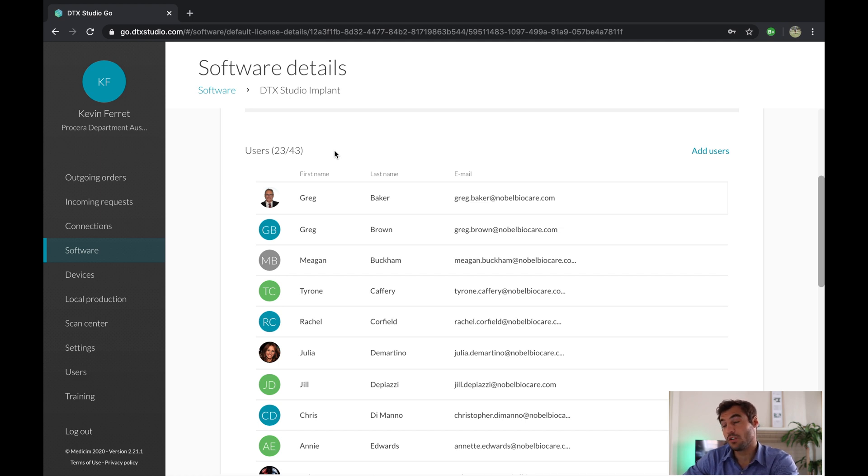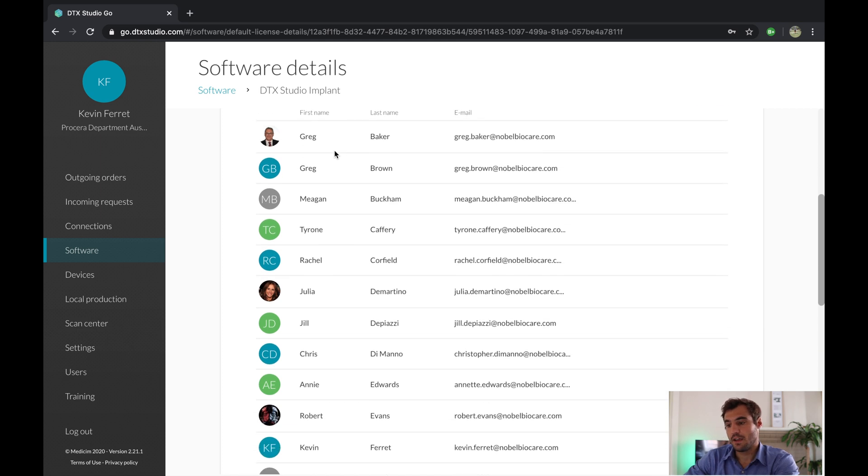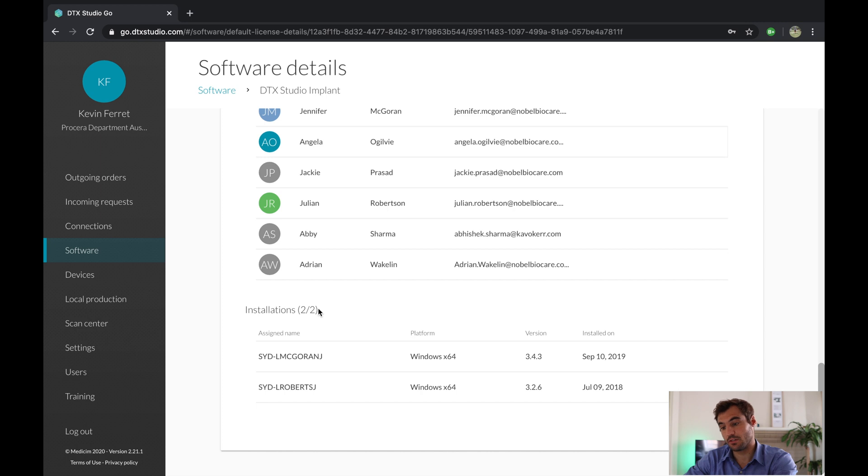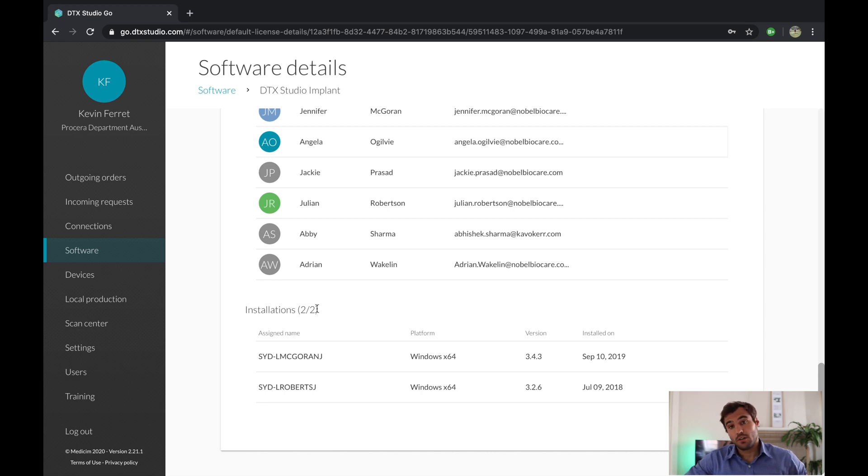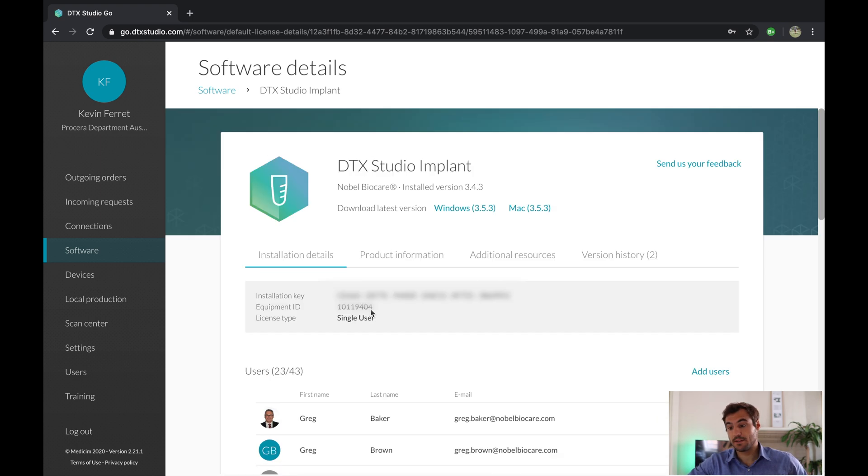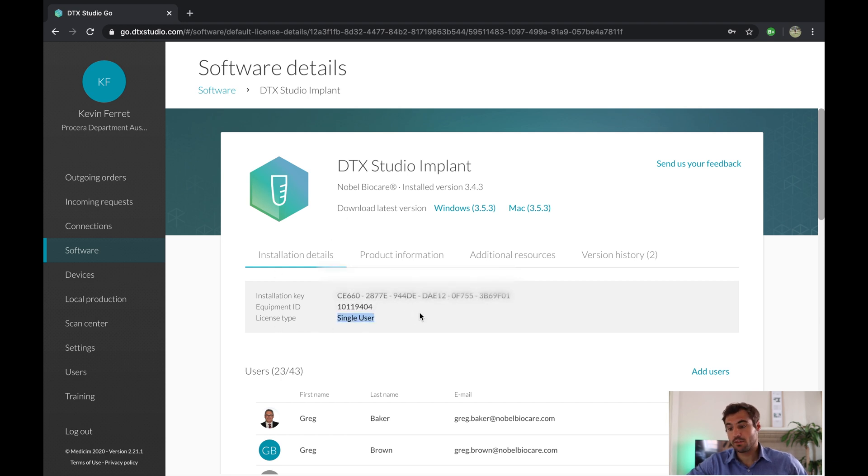And all the way down to the bottom, you've got the installations. So installation is how many computers can you install that software and use the same key. So here we only have two installations, simply because it is a single user license, not a practice user license type.